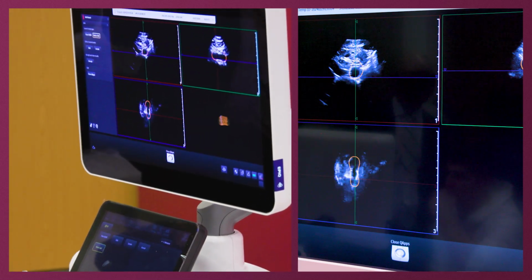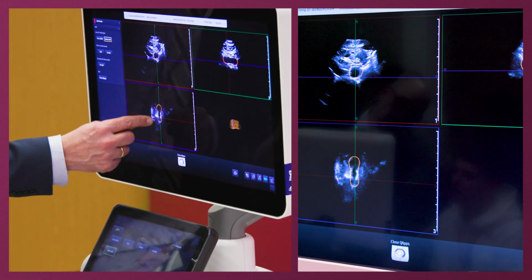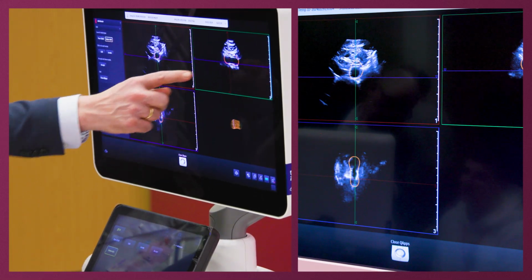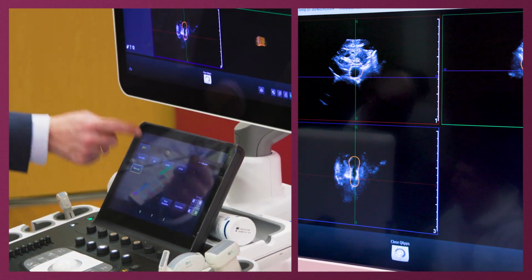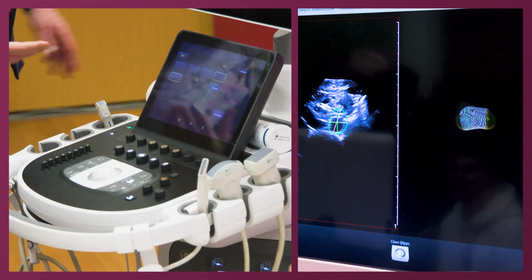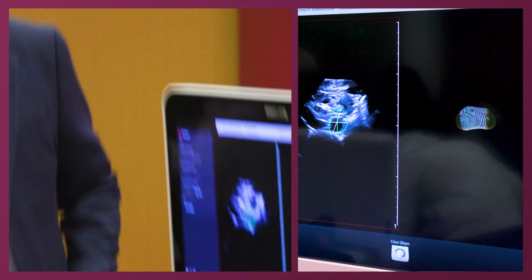So now it's thinking, and then you can. I think it looks a little bit strange here, to be honest. Yeah. And you can see this is for sure not right. No, for sure. But if we want to measure, then you just push accept, and then it gives you your measures. It's not right. No, it's not right. So next one, you can try to work on.